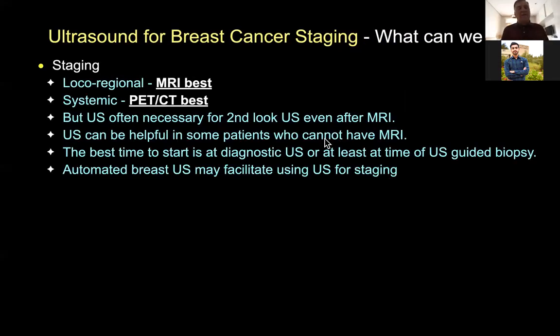So what can we say? Well, again, I think in the United States, for local regional staging, we feel MR is the best. And for systemic staging, we think PET-CT is the best. But second look ultrasound is often necessary, even after a positive MR. And ultrasound can be helpful in some patients who can't have MR.